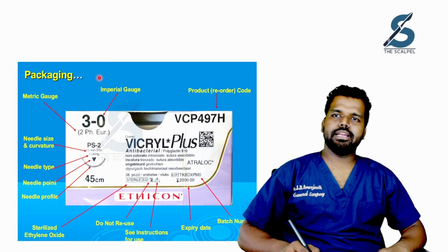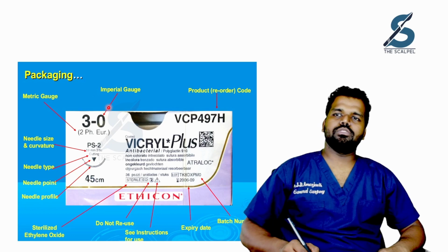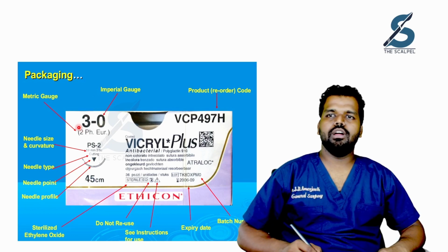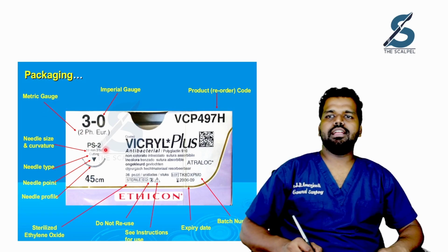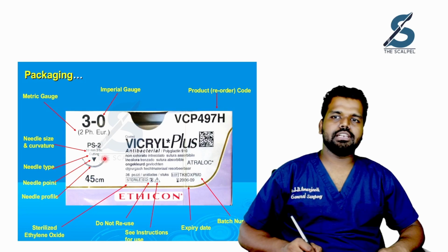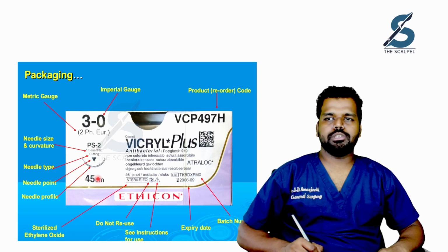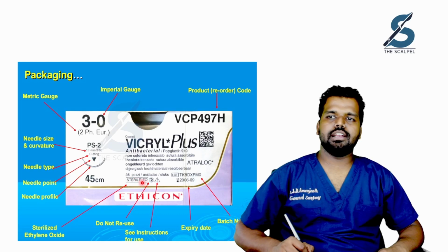In this image, you can see the parts of a suture needle sachet. This denotes the size of the suture material. This is 3-0, and this is the imperial gauge size, and this is the metric gauge size. Here you can see the length of the needle, whether it's cutting or reverse cutting, and this shows the length of the suture material, and this shows whether it's sterilized, and if so, with what.